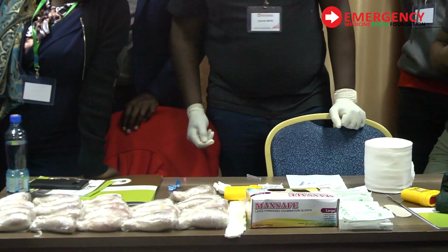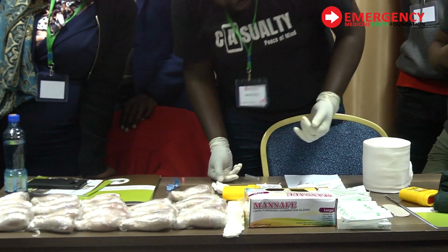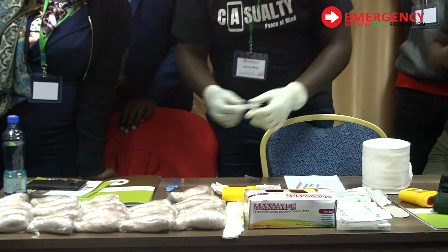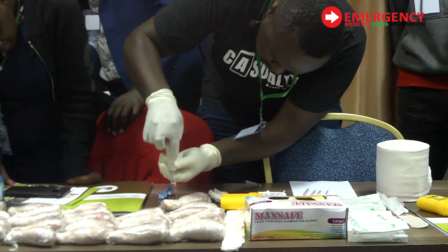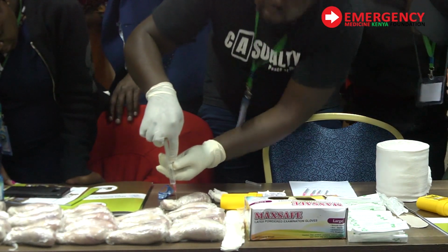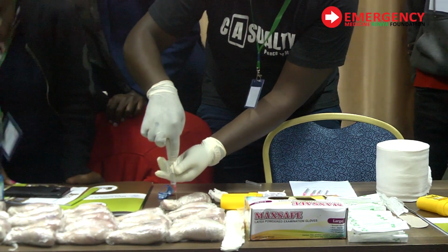How long did that take? Short time. And now, I can aspirate. If there is no blood, please understand, the chicken overstayed, but I believe there is some blood. You can see that? Good. The lesson is over. It's time for practicals, unless there is any question.